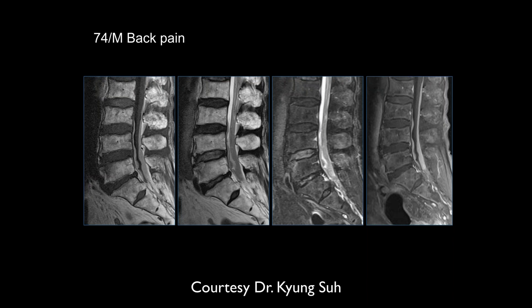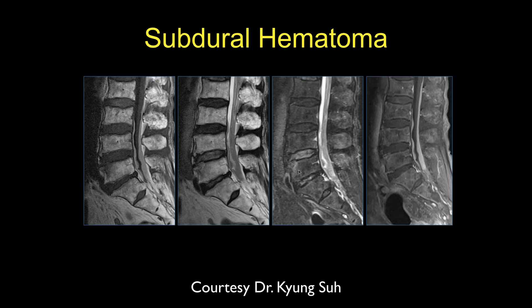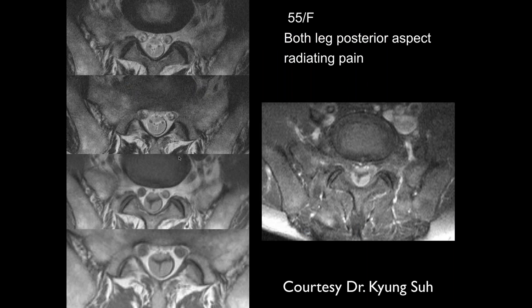We have the high signal here which looks like it's compressing the thecal sac, so it appears to be outside the thecal sac. This was a subdural hematoma and you can see it extends up and down the spine, which is pretty characteristic of a subdural hematoma. The axial plane can be very helpful to evaluate this.